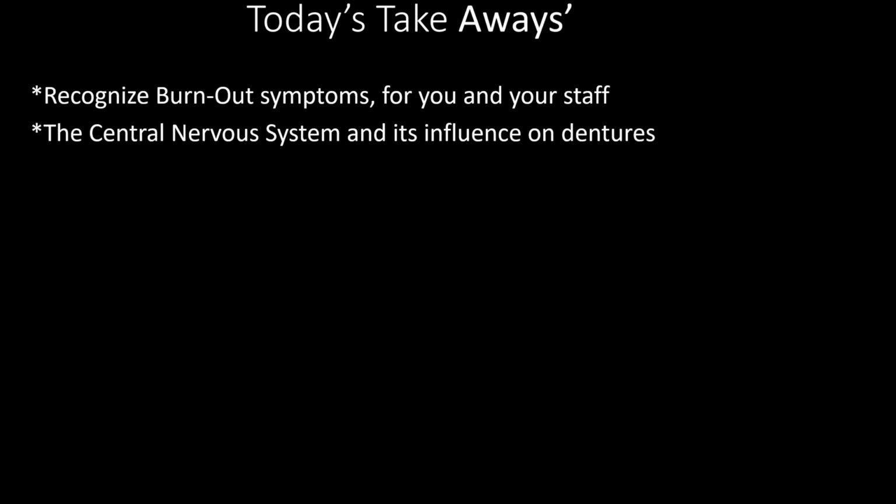So when you change the vertical, you change the bite cycle slightly, you're changing the pattern that someone's been used to. So where I'm getting at on this, and again, I'll just pick on the technicians: you have that case come back, it's come back again, the doctor's on the phone going, we're all frustrated. And that's when I need you to stop and go, tell me about the person.